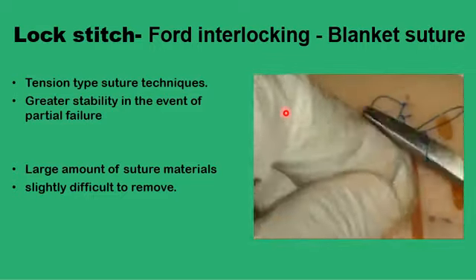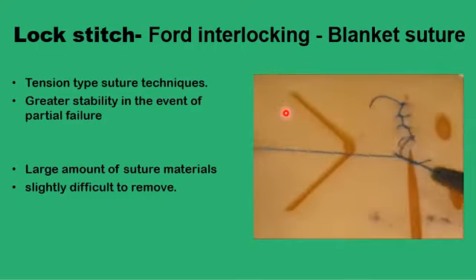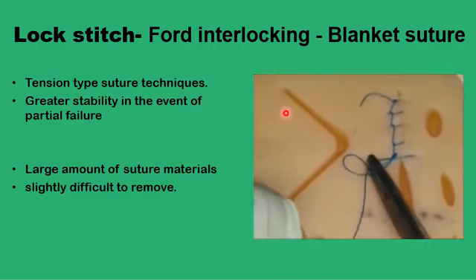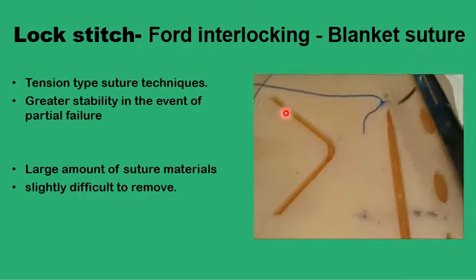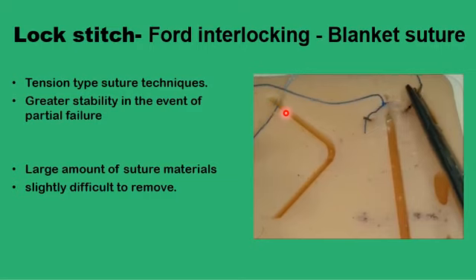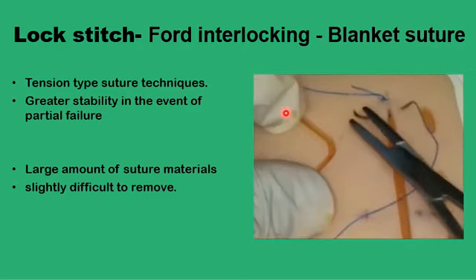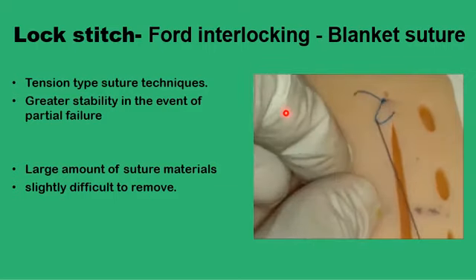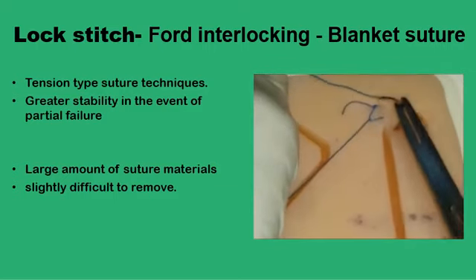You consume more suture doing this, and it's also more difficult to remove. That's the final stitch now, and you leave a loop on one side and tie that loop to the single thread on the other to finalize the suture line.